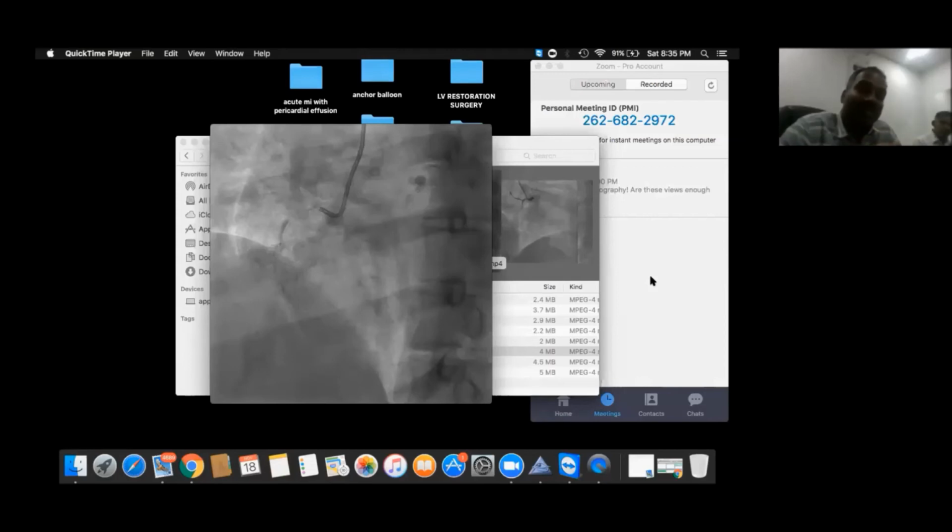It happens. I had one case where the venous graft was very posterior. I never imagined a surgeon would give such a posterior anastomosis. If the surgeon doesn't want a cardiologist to do an angiogram in future, that's what they do. It's very tough. But even in a posterior graft, MPA works. In that case, MPA helped me.